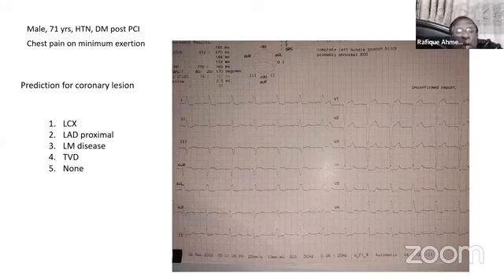Thank you. So I think this is interesting, because if I gave this ECG without any history, we will not think much about it, as Jamil mentioned. But with the clinical scenario, one of the interesting things is that after the cardiac cath we would have put a balloon pump in this patient, and that would have hopefully prevented this middle-of-the-night CABG and given us some time. That's one thing that we do with this kind of left main patients.